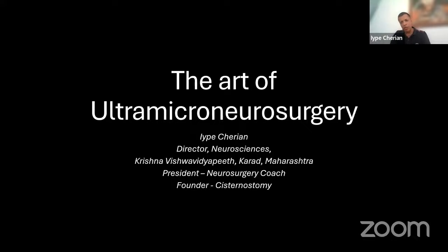And when I got the Kinevo, after I joined here in India, the top guys at Zeiss called me up and said, "Oh, presumably you want the same thing in this Kinevo also." So we said yes, and they got it done for us. So the Kinevo also has a 40 zoom.